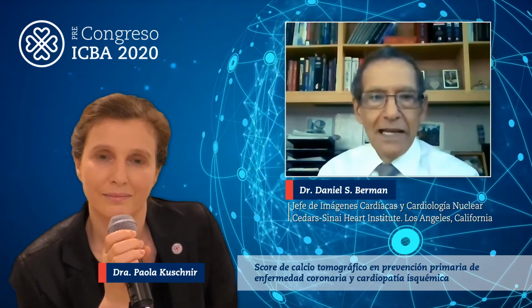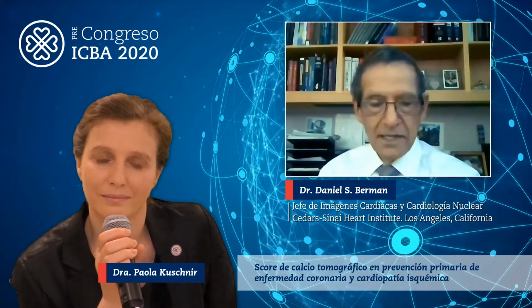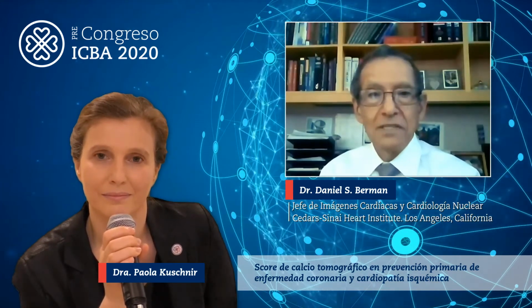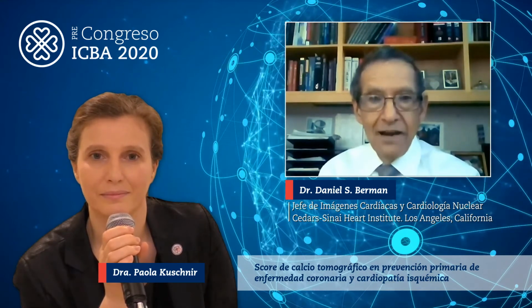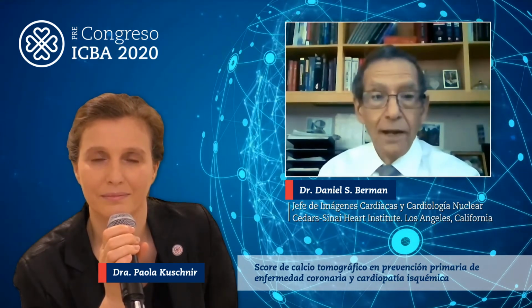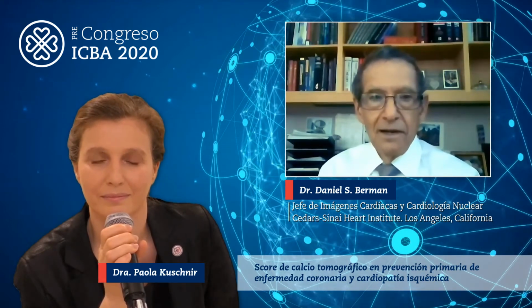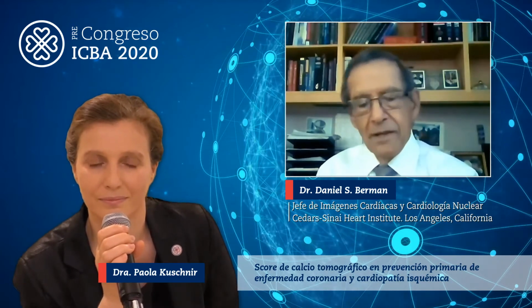For every increased grade of calcium, there is an increased risk. It's interesting, even in the lowest score, 1 to 9, that lowest minimal calcium category, the risk is higher, approximately 2 to 1, over the risk of the patients who do not have any calcium. And that's with that minimal score.